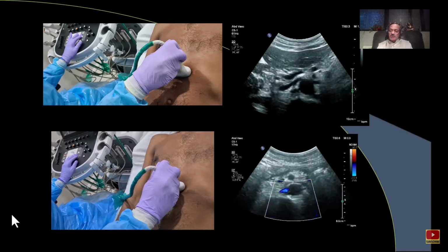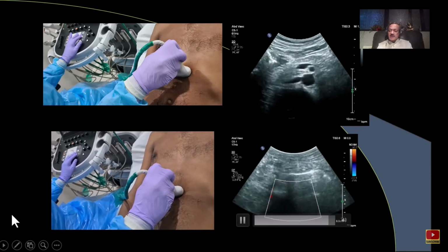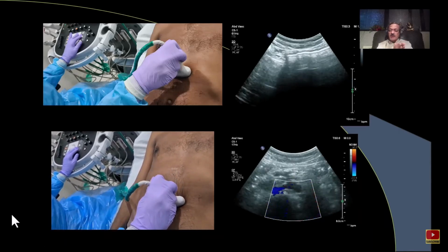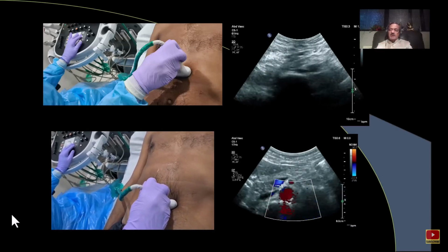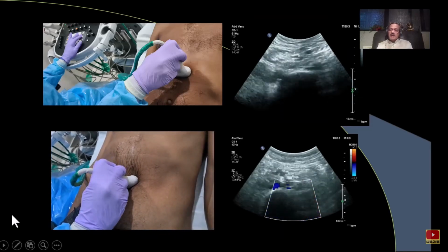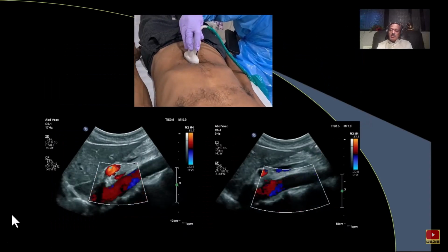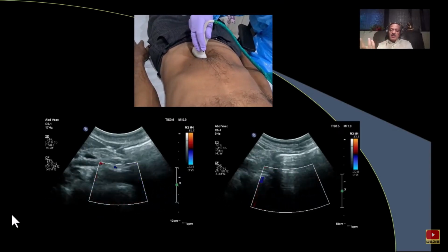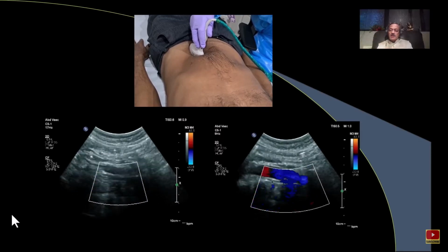Always begin with the aorta in a longitudinal plane and in a transverse plane. Now, transverse plane is again very important because sometimes the aorta becomes ectatic, or you might have a focal aneurysm, and you might miss a part of the aorta if you do it only longitudinally. So this again gives us a good idea about the walls of the aorta. The longitudinal again is very, very important because you can pick up atherosclerosis, you can look at pulsatility of the aorta, which can be a clue to several diseases, and we can go right up to the bifurcation of the aorta.